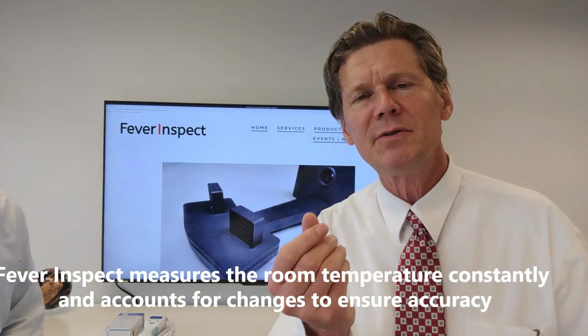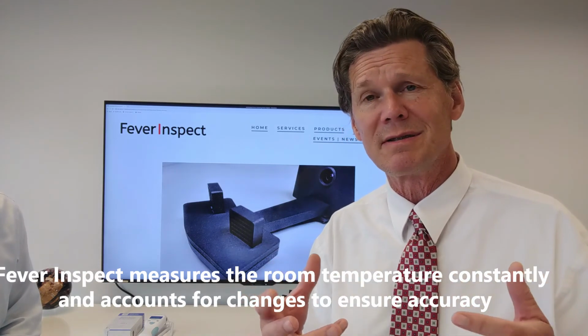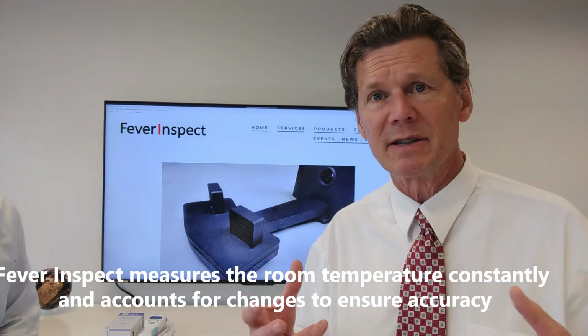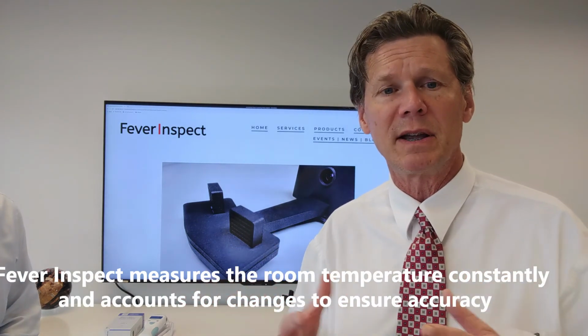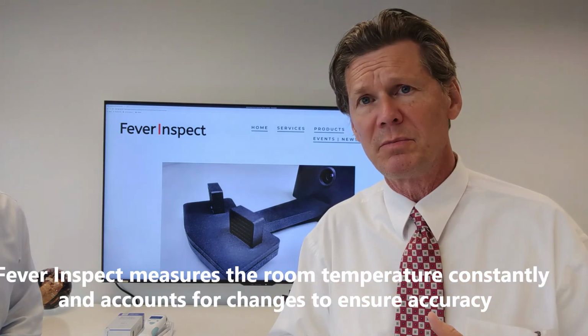But you need to do the same kind of thing with an infrared camera, and what we've seen in real world conditions, schools, retail environments, professional buildings, all the places where our devices are being deployed, is that it's important to capture that ambient room temperature.